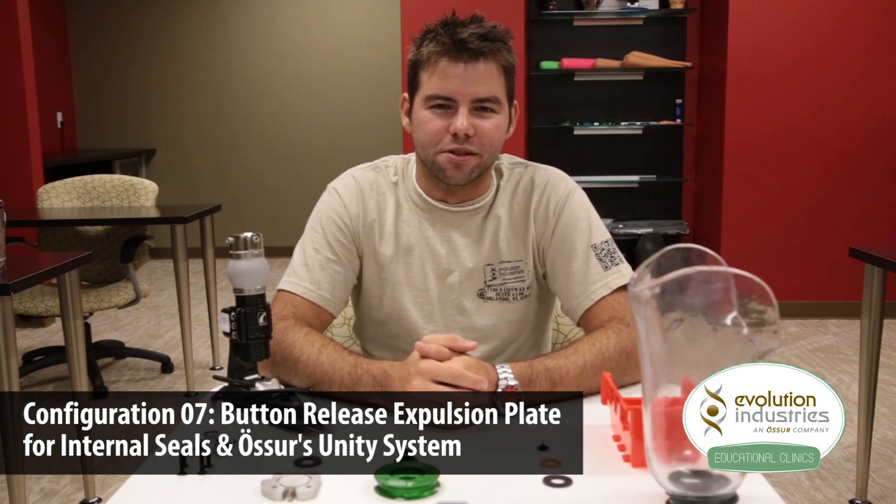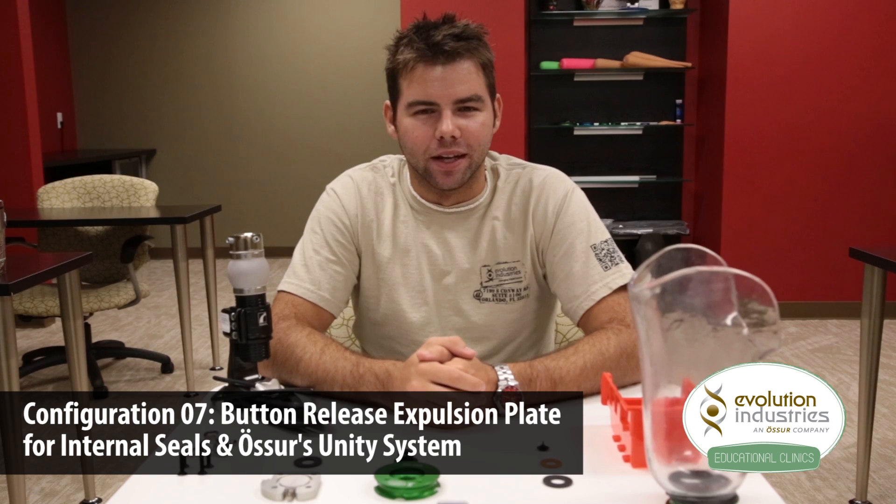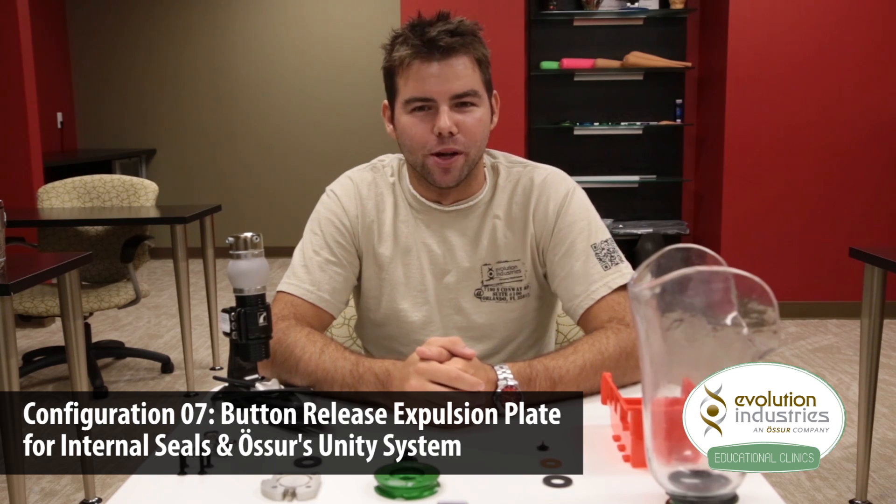Hi, I'm Jeremy and I work in customer service here at Evolution Industries. This is an instructional video on how to set up Evolution's new Unity Plate system.